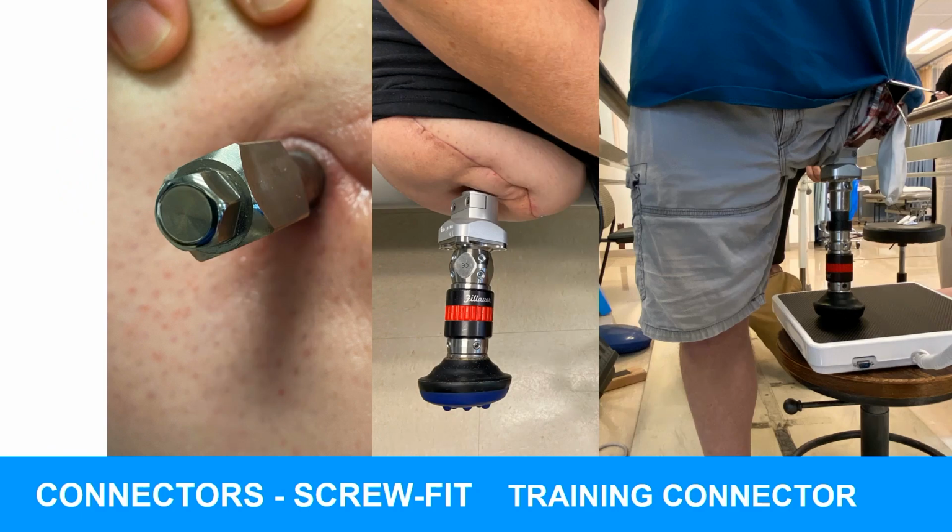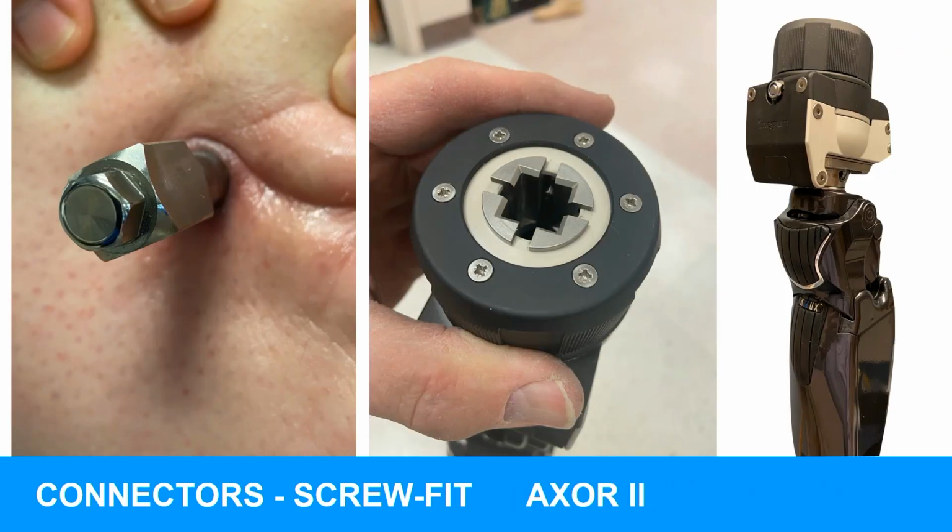One is an initial loading pylon, or an initial connector that attaches with two 4-millimeter screws, and that's called the training connector used in the initial rehab. Once the patient's approved for a full-length prosthesis, then the Axor 2 is used. These are fairly expensive devices and should be replaced every 5 years. You rotate counterclockwise to insert the abutment and then tighten clockwise.